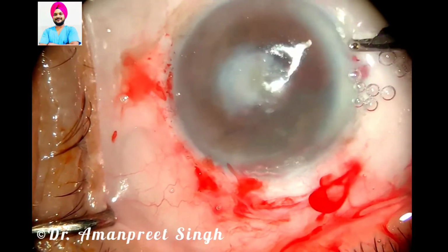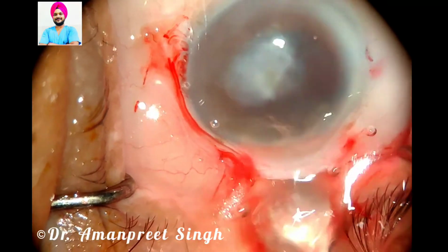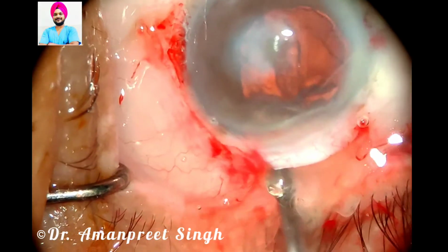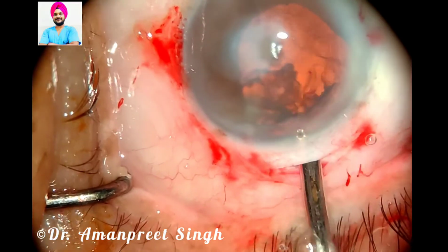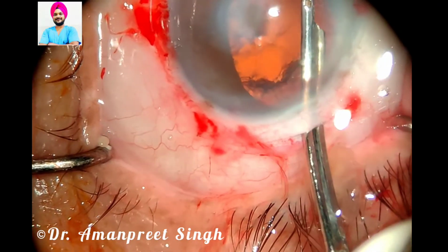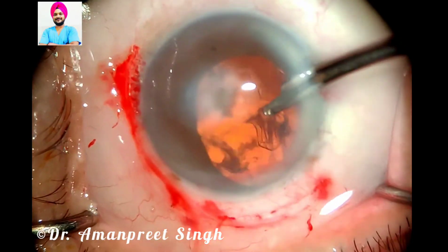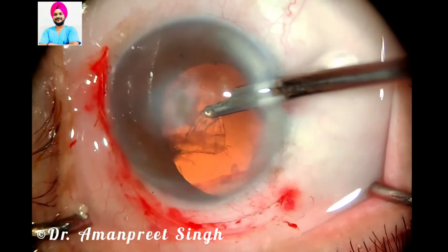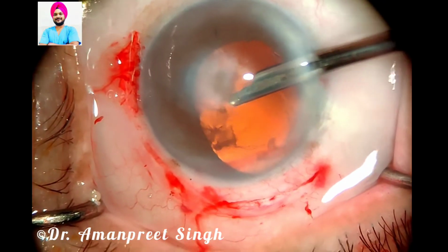Now it's the time to do irrigation aspiration with the help of Simcoe cannula. Just pressing the posterior lip and all the cortical matter that is stuck inside the incision is coming out. So with the help of this we have removed the cortex, and so with the help of again Simcoe cannula the cortical lens fibers are removed. Here I am facing a little bit of difficulty because of the corneal opacity.